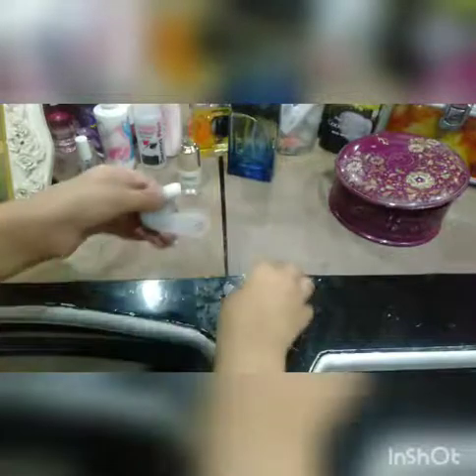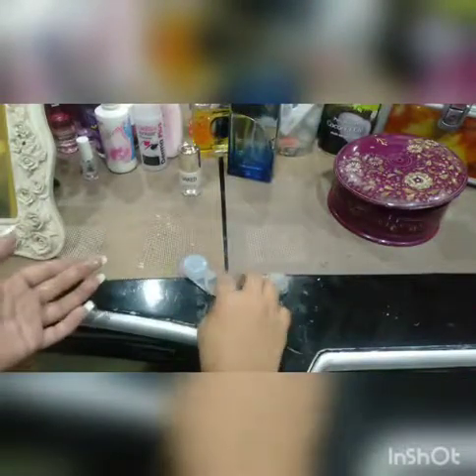So let's apply. So guys, first of all, the first step is storing. First of all, when you apply it, first of all you have to remove the lens from it.